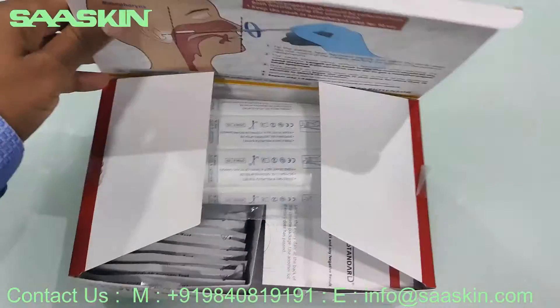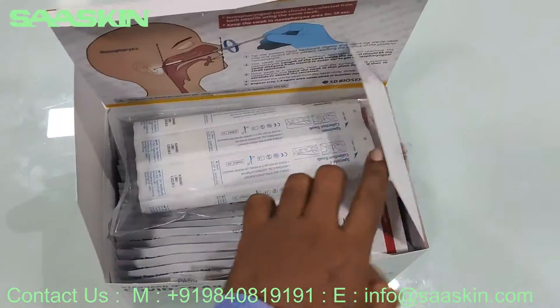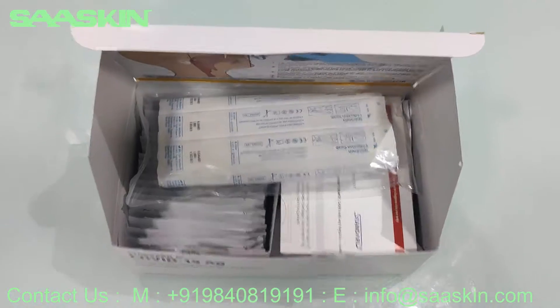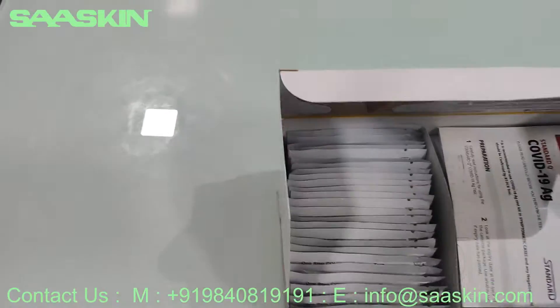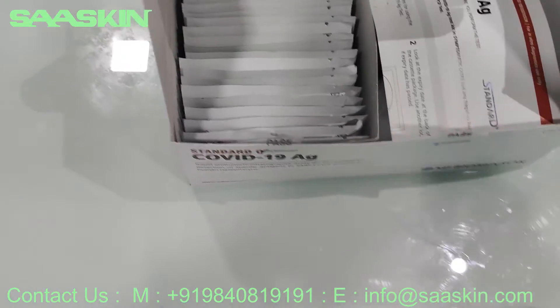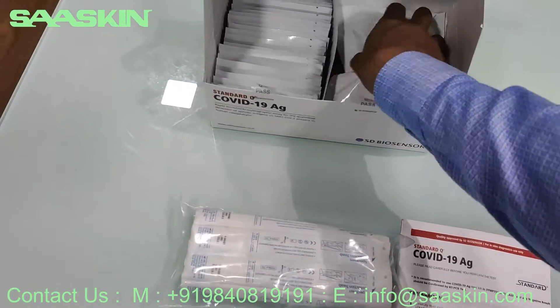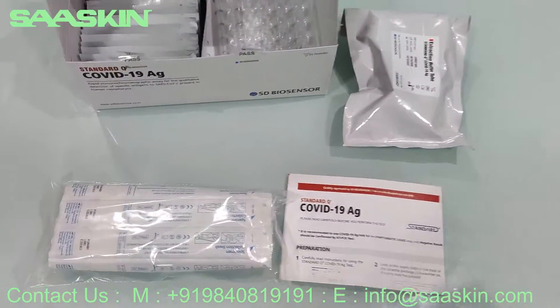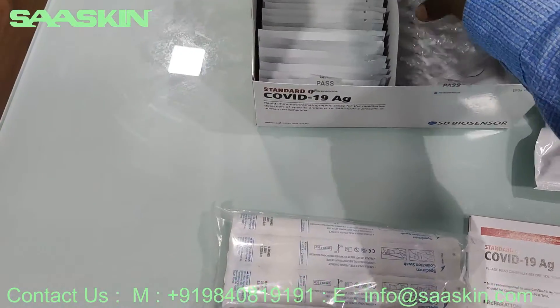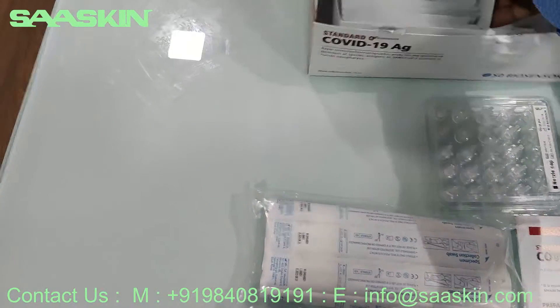Let me open this box for you. This is how the box looks on the inside. Okay, this is the sterile swab stick, 25 numbers. And the instruction for use paper. You also have the extraction buffer tube, the nozzle caps, and the test cassettes.